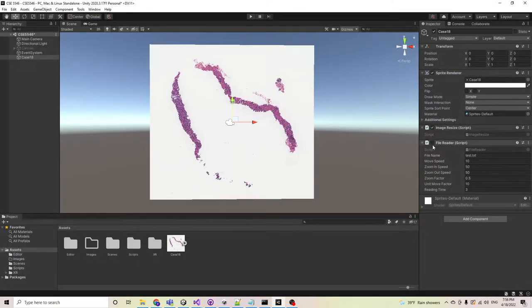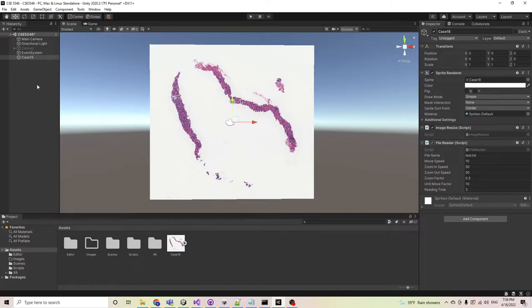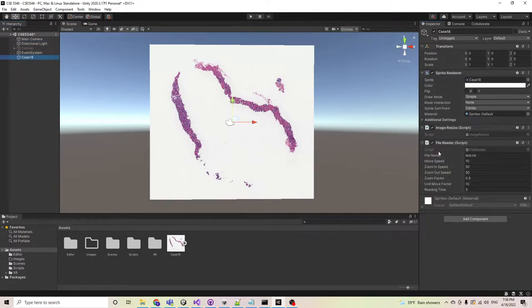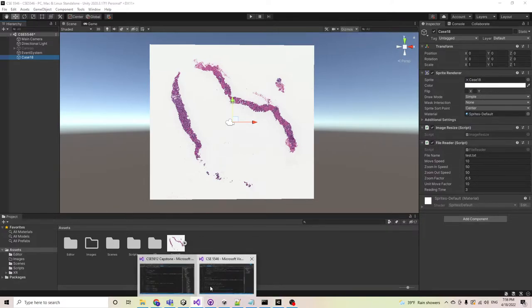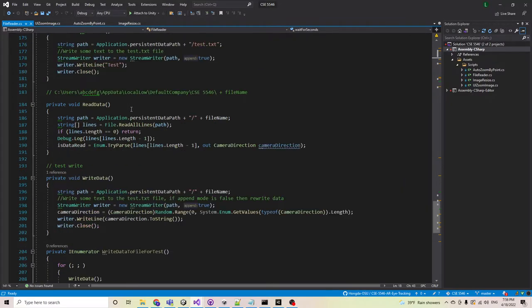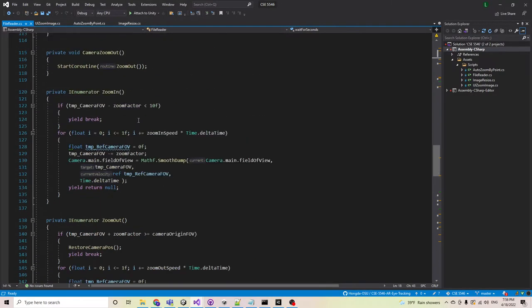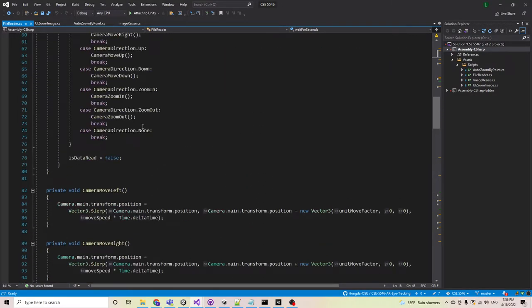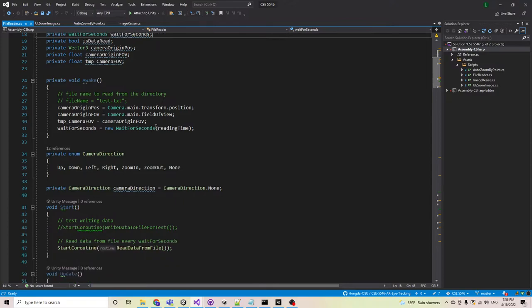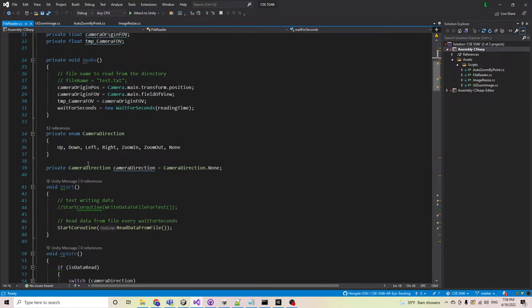So the last mode is file simulation mode. In this mode, we need to enable the file reader and disable the auto-zoom by point script. I'm going to simulate and analyze tracking the user's eye movements with these different directions: for example, up, down, left, right, zoom in, zoom out.